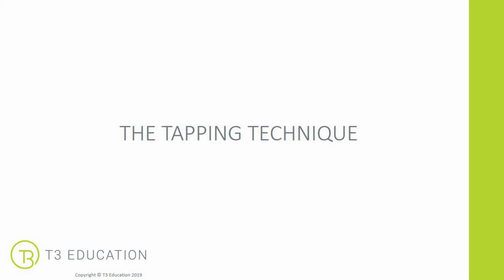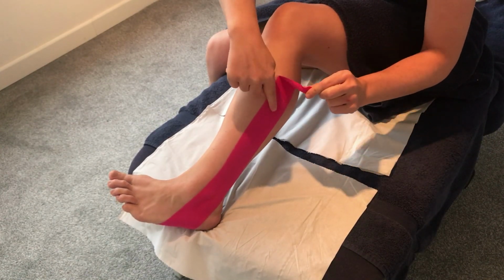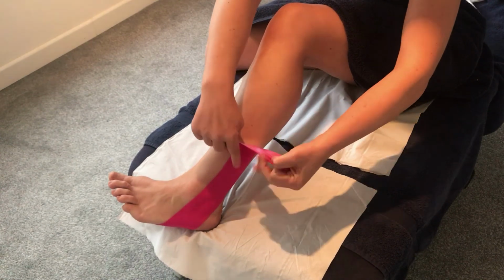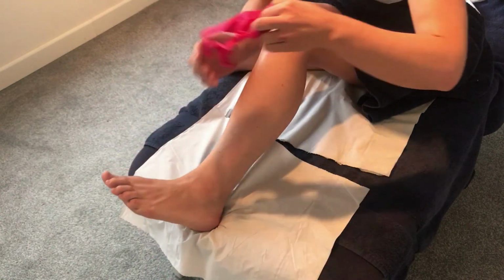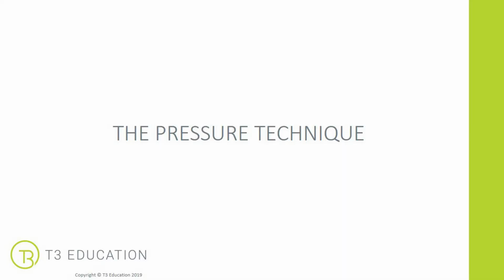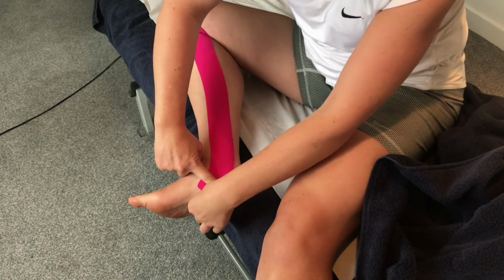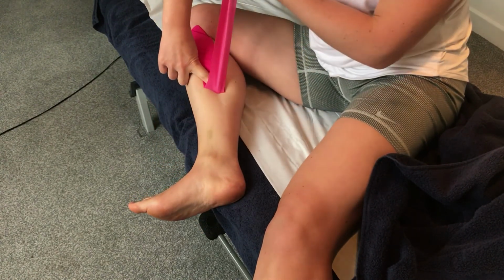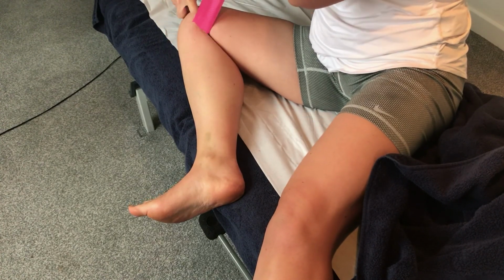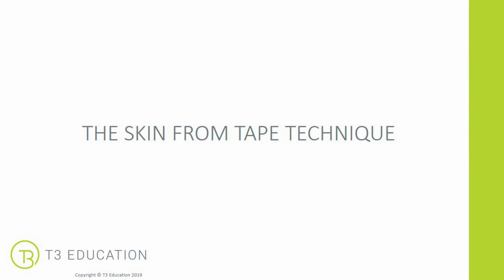The first is the tapping technique, and it requires, as your client pulls the tape off their skin, they apply a tap with the opposite finger on the tape as they start to peel off, and it creates that distraction technique as they remove the tape. The pressure technique. This requires pressure with one finger on the tape as you peel the tape away with the other hand. So as you slide the tape up away from the skin, that pressure is maintained with that finger, creating that distraction technique.